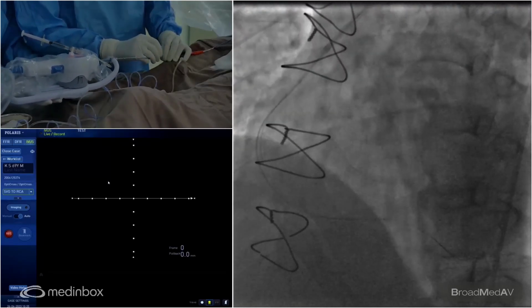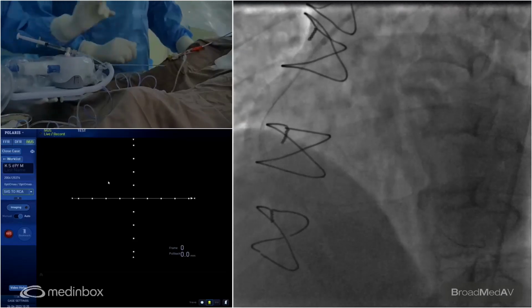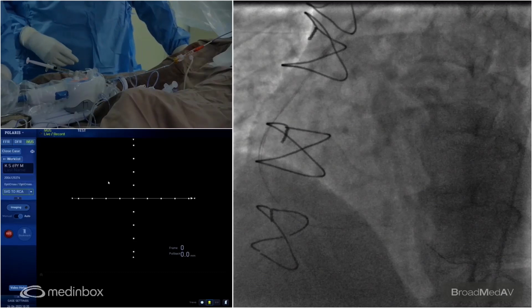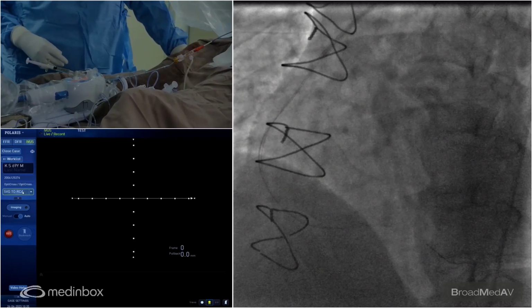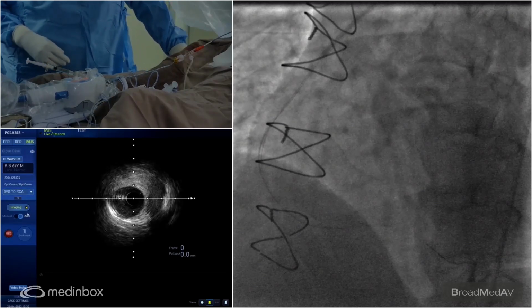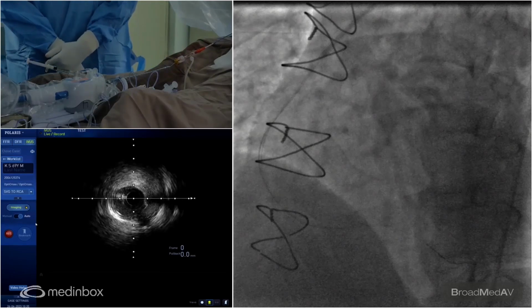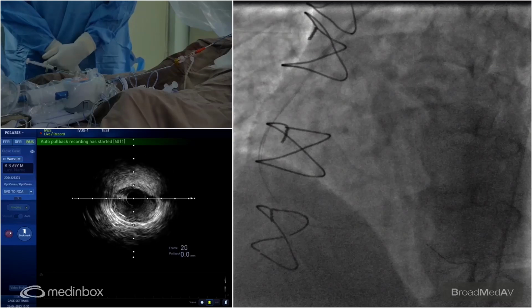You have crossed distal, sir. Okay, and now we'll take some pictures. So we have put the machine on. Get the IVUS pictures, please. Imaging ready, sir. We've gone down, and this is the live view, distal RCA. It's in the native vessel and it's pulled back. Recording, sir.